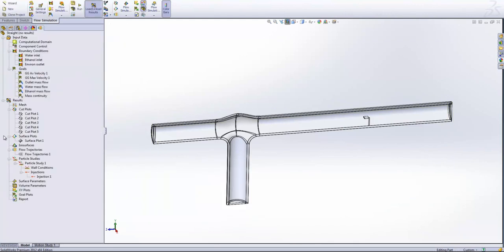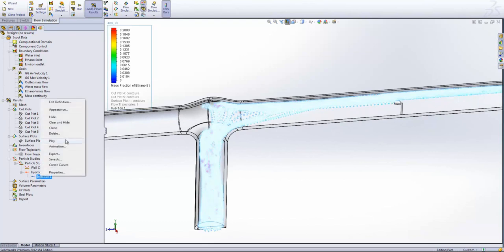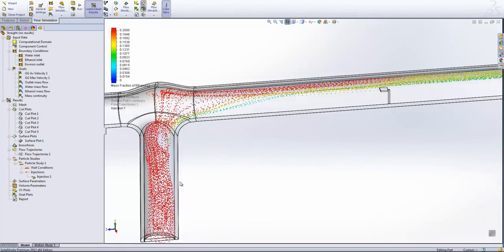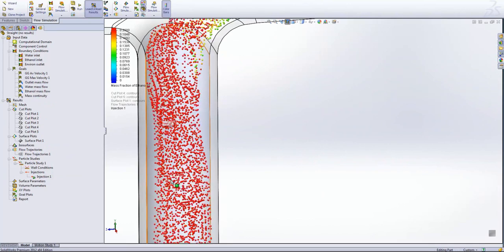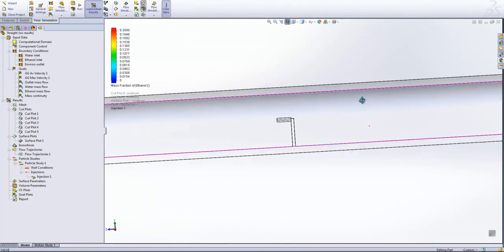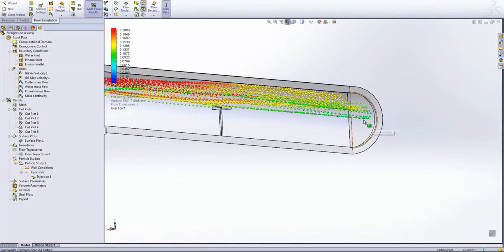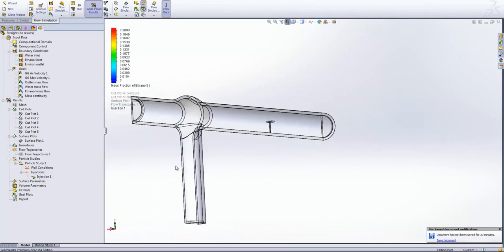And then what the system's going to do is inject those particles and allow us to review how they move through the system. So here, if I just click play, we can animate how those particles move through the tube. So we can see the particles coming in. You can also see a certain amount of the particles moving downwards, and that's a result of that water flow pushing back down. Then you can see how these particles move, and the majority are moving over the top of the sensor and ending up solely at the top half of that outlet lid. So we haven't got many particles coming through to the bottom there.